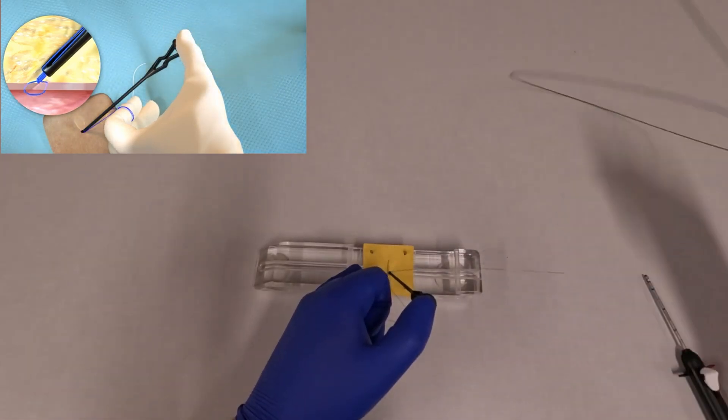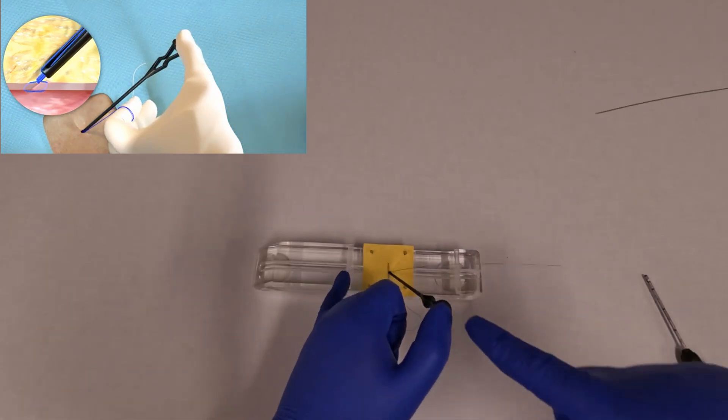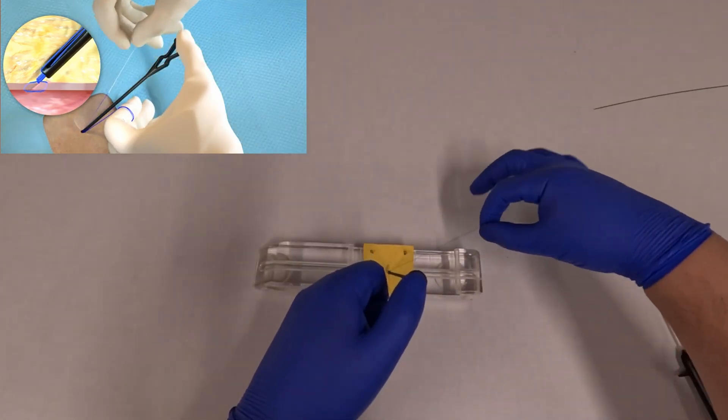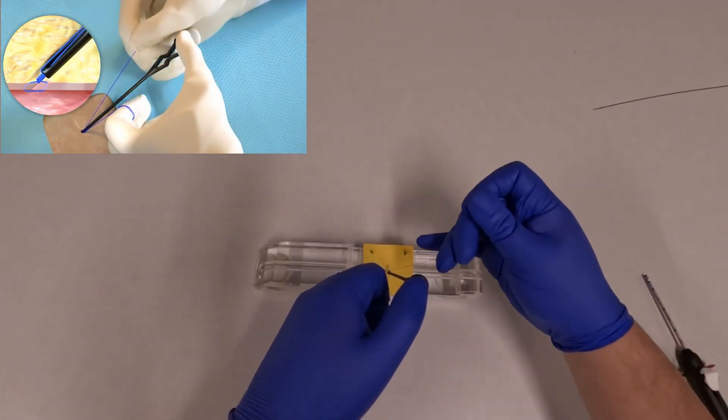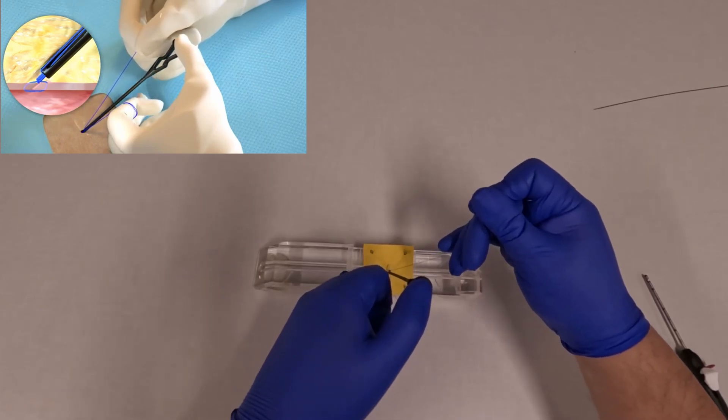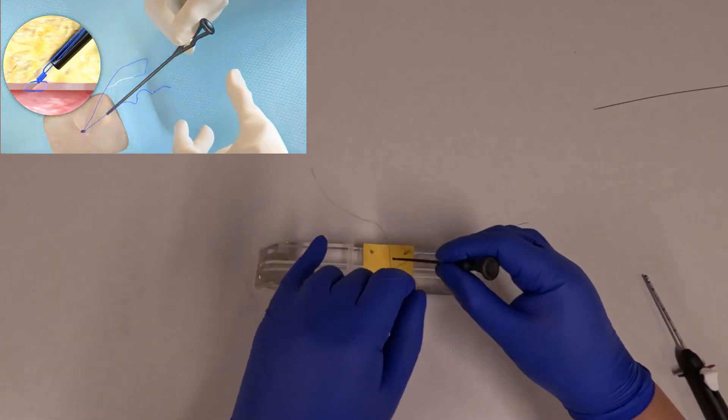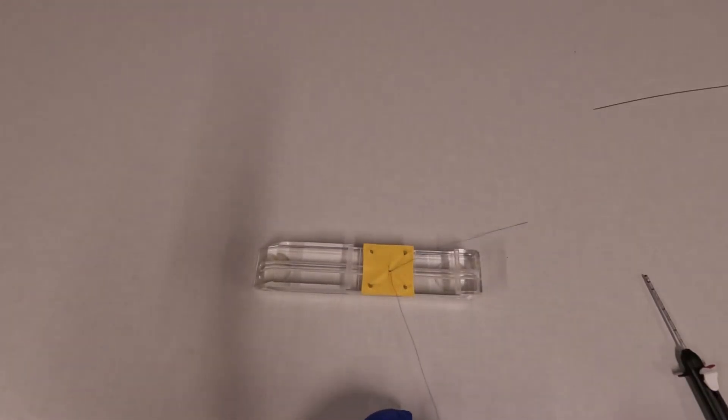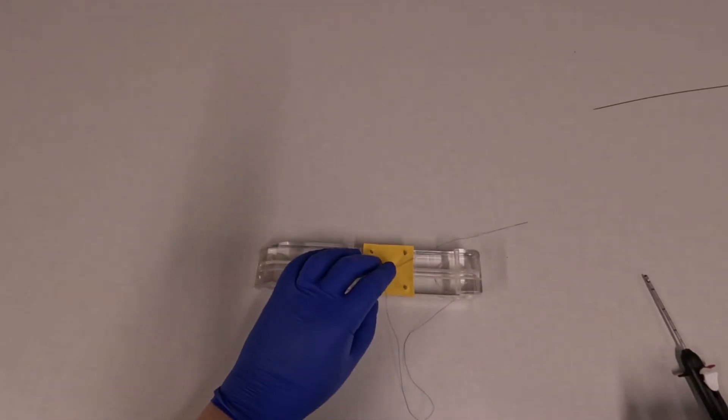At this point we can remove the guide wire that we had placed, and you're going to tighten up a little bit more with your left thumb, just to take up the space when the wire came out. At this point you can pull on the white suture to lock that suture in place.